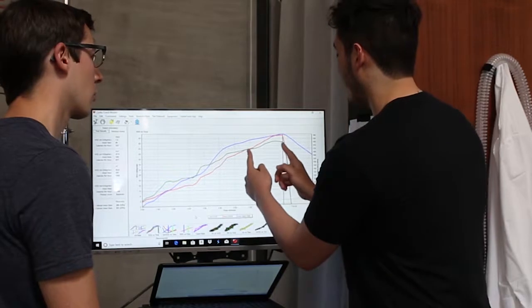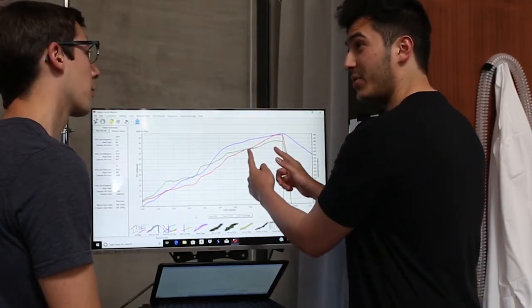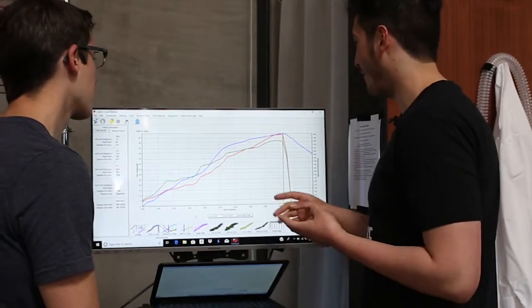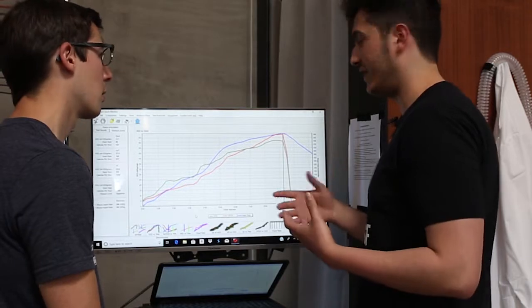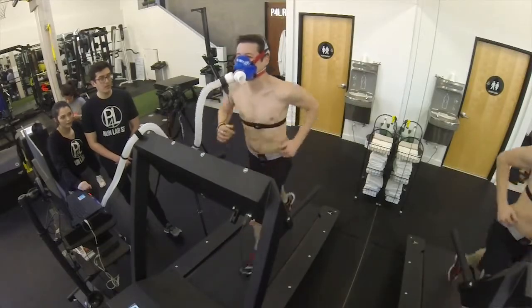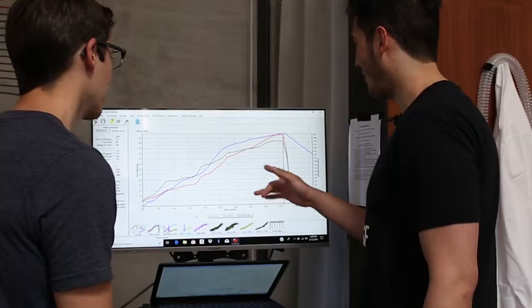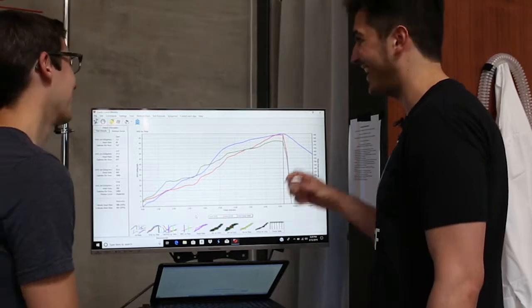And then this point right here, all this, is when you're using those other energy systems to contribute, right? So it's not sustainable, max 3 minutes, right? So usually when this point happens, I know as a lead tech that we have max 3 minutes left. You made just about 2.5 minutes, which is really, really good. The max I've seen was 4 minutes. That was me. So I just kept going, right?